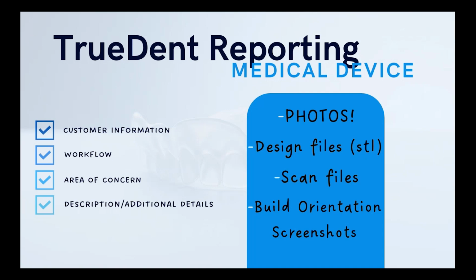Workflow, is it a denture? Is it an immediate? Is it a reference or something else? The area of concern is actually the area of the denture. So is it the midline, the palatal base, teeth, interproximal, whatever area is affected by whatever incident you're currently experiencing. Please document that. Any descriptions, additional details, the teeth were green, not that that happens, but just off the top of my head, that's what came out of my mouth. Anything else that can help us find whatever your issue is and focus in on a solution.